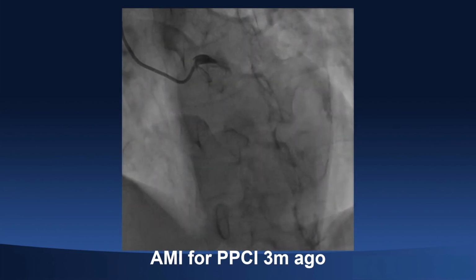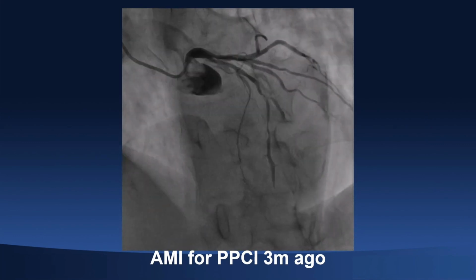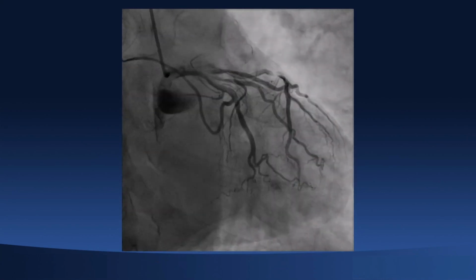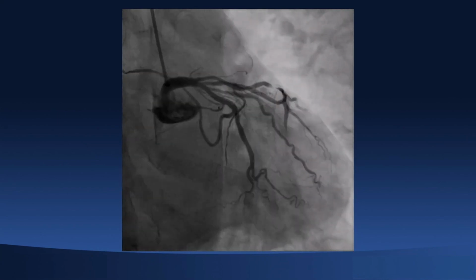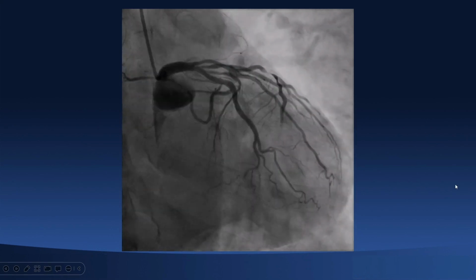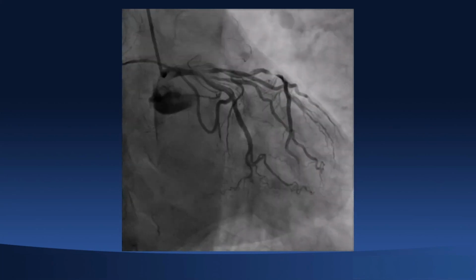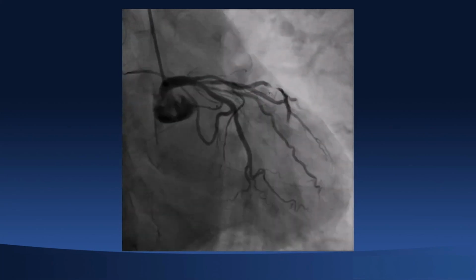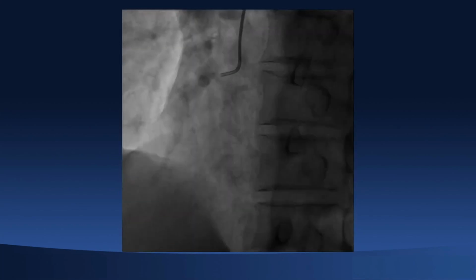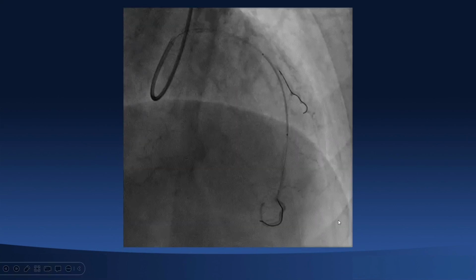We can see the calcified lesion in left main and 80% stenosis in proximal to the middle LAD, with LAD fourth diagonal branch is a true bifurcation lesion and relatively normal LCX, with 60% stenosis in OM and 70% stenosis in proximal to middle RCA, with severe calcification after stent deployment in LAD.